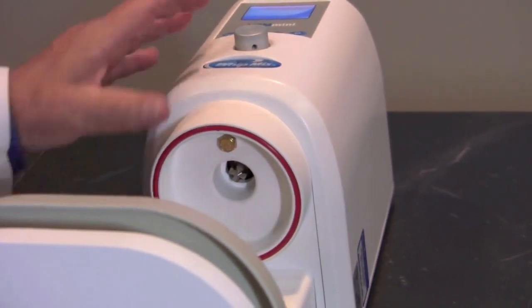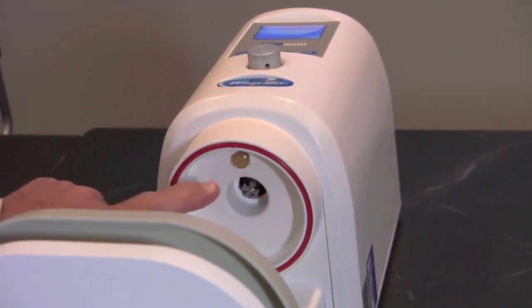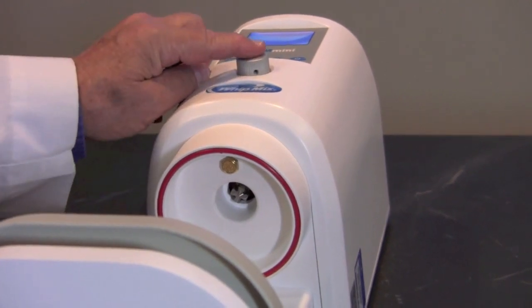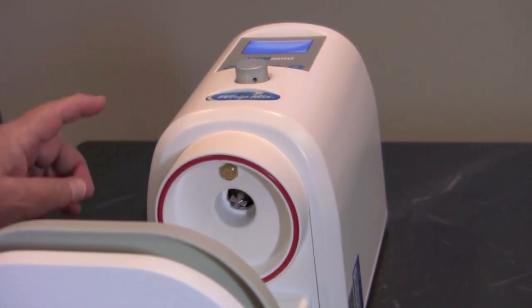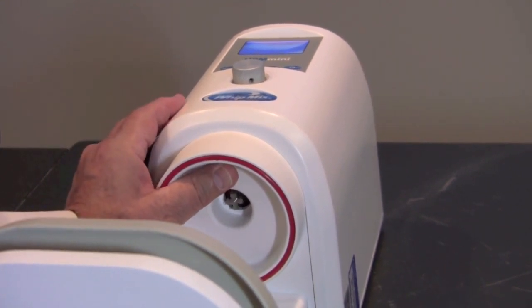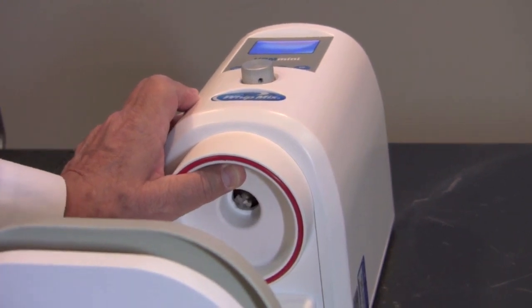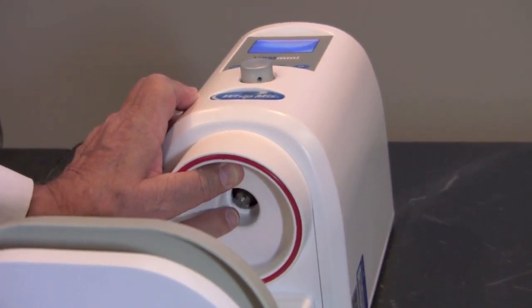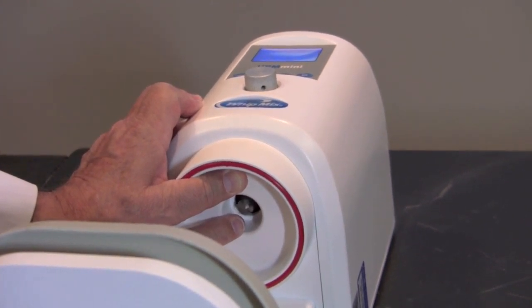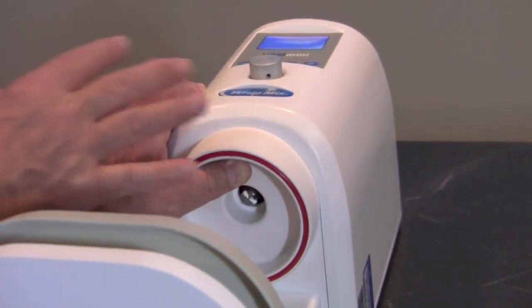We're going to check the machine now to make sure it is pulling vacuum correctly. To do that, we simply turn the machine on with a program and let it begin to run, then place our thumb over the screen — and you can hear the vacuum being pulled. Once the vacuum has reached a sufficient level, the drive nut will be turning down here. That tells us that whatever the vacuum problem is, it's not a problem with the machine itself.